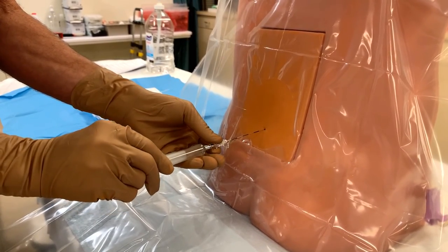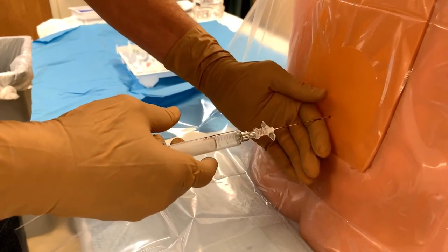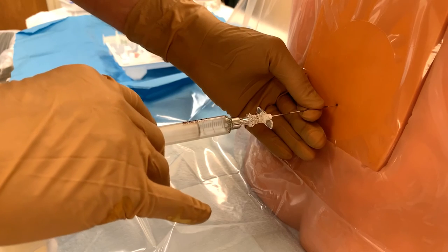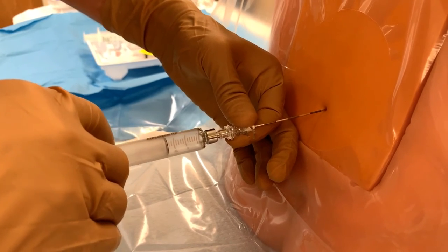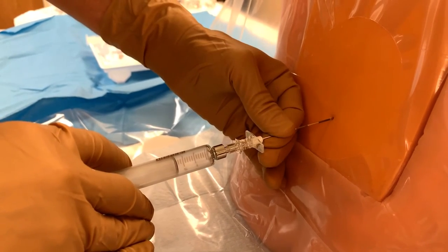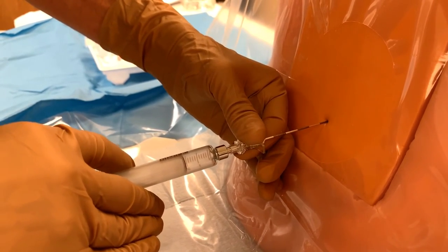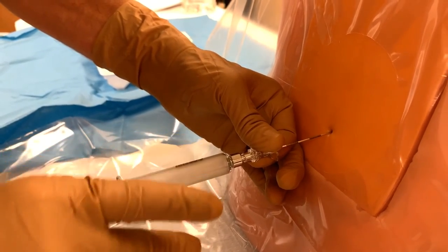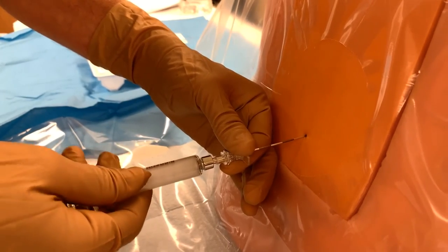We'll attach this to the epidural needle — we should have a nice bounce there. Now placing my hand against the patient's back and my fingers on the needle, we'll advance slowly about a half centimeter at a time, testing the bounce as we advance.